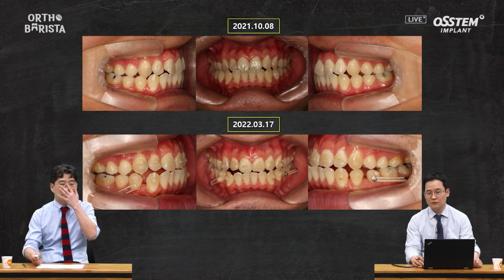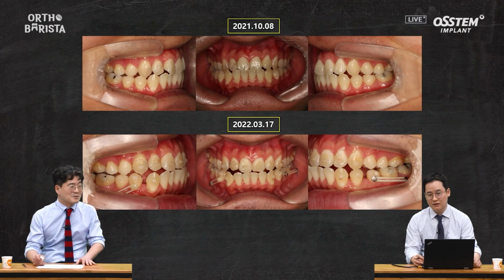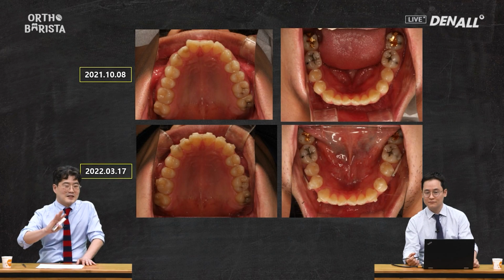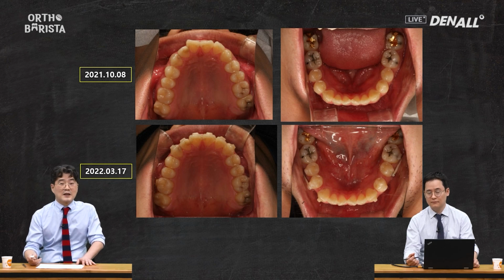For this amount of movement, compared to traditional orthodontic methods, the time frame of around 5 months appears to have been sufficient to achieve the desired results. That's correct. You might wonder if the movement was achieved solely through the use of screws, but the screws were applied after the number 7 tooth had moved. As you'll see shortly, the posterior movement proceeded sequentially, with the number 7, number 6, and number 5 teeth moving serially.